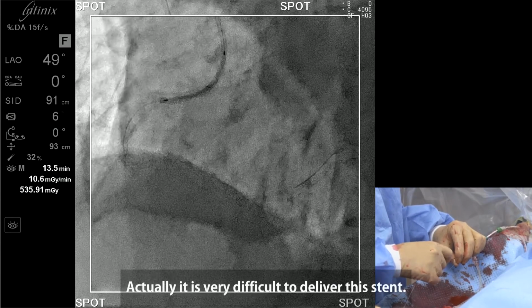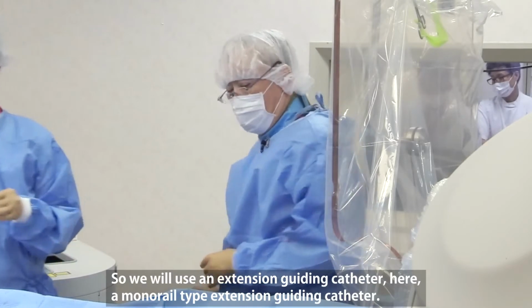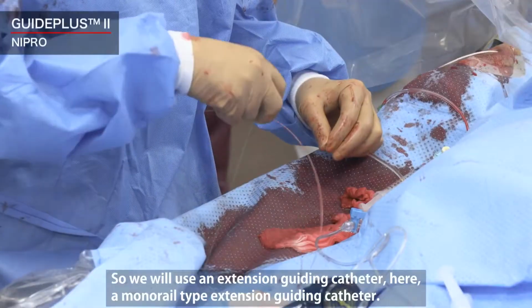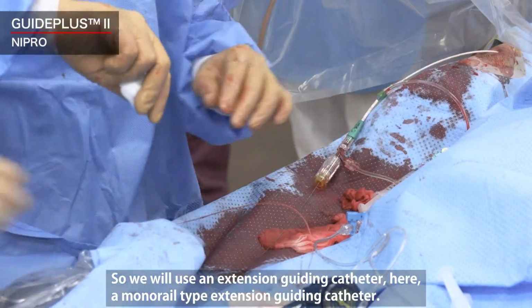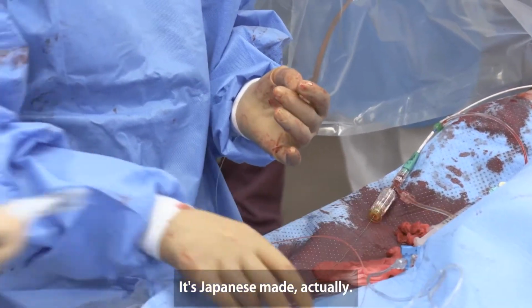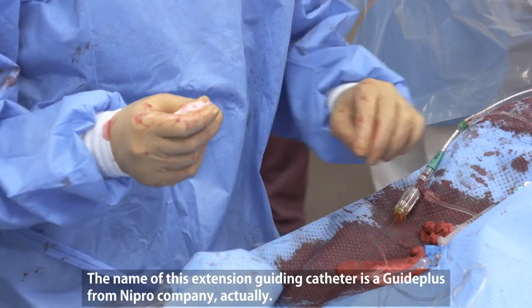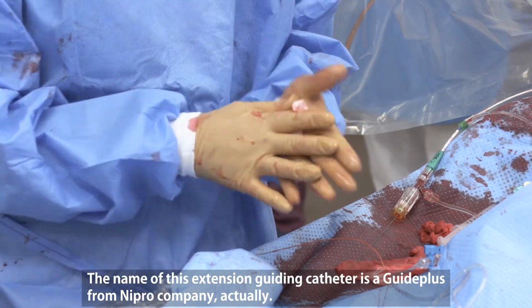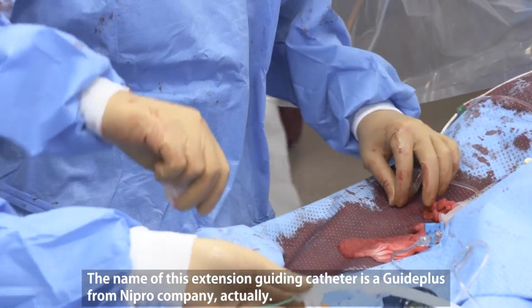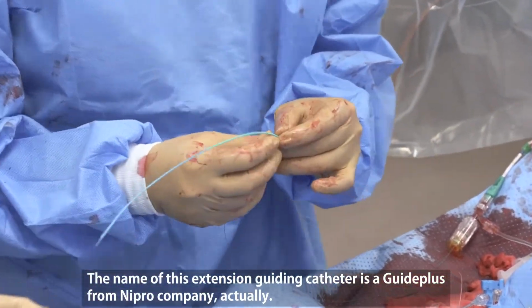Actually, it is very difficult to deliver this stent. So we'll use an extension guiding catheter here, a monorail type extension guiding catheter. It's Japanese made. The name of this extension guiding catheter is Guide Plus from Nipro company.